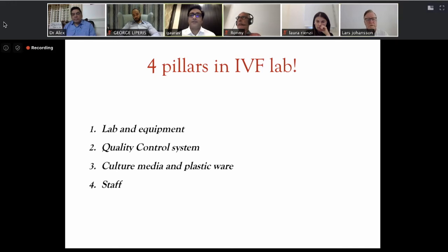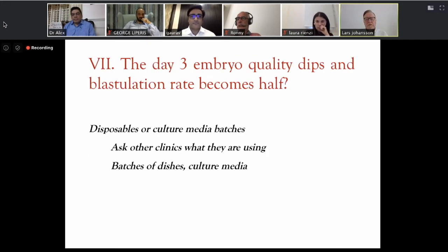What about culture media? Culture media, definitely. Since I've been a lot in Asia, when you are aliquoting a lot of media, you take it from the produced controlled environment in the dishes and put it in a test tube that is not embryo tested at all. So you take up a lot of toxins, and then you use that for making the mini droplets or anything you do. That is a big problem, actually.